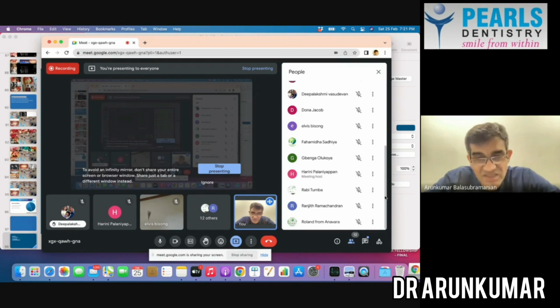When it comes to digital dentures, dentures are given on the patient's gum structure without teeth. So they just rest on the gum structure. When they rest on the gum structure, our gums and the underlying bone undergo a process called alveolar ridge resorption. Our gums keep shrinking over a period of time. Digital dentures, because they fit very well, help to reduce the amount of shrinking of gums that happens. However, even though they reduce the shrinking, the shrinking of gums is a natural process. It happens when we lose teeth.